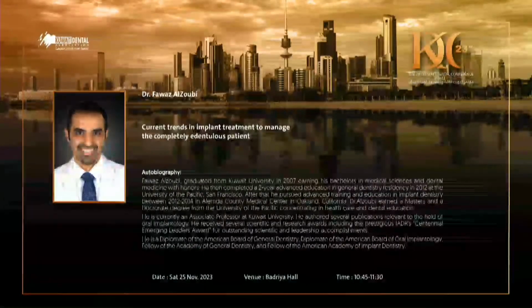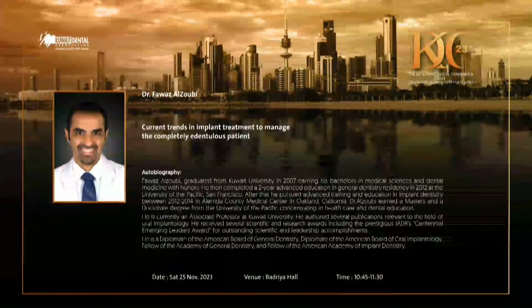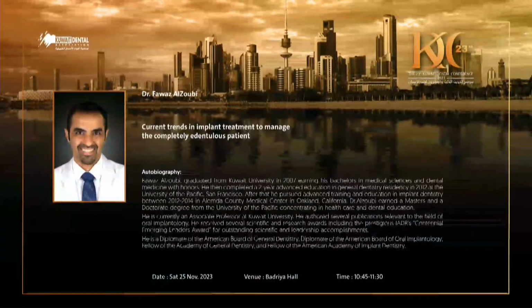Not with the workflow I just described. Maybe I haven't done enough cases to realize that, but so far, alhamdulillah, with the cases that I've done, I never had a problem with a well-adapted prototype that yields an inaccurate zirconia-based restoration. I'm not sure if that answered your question.